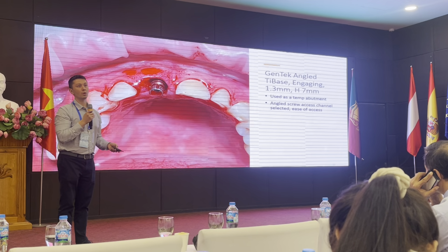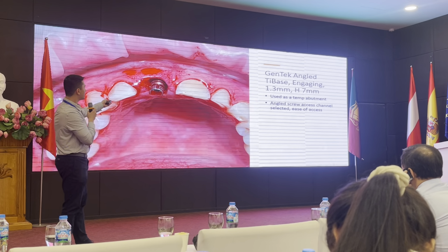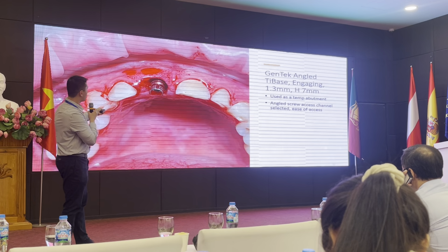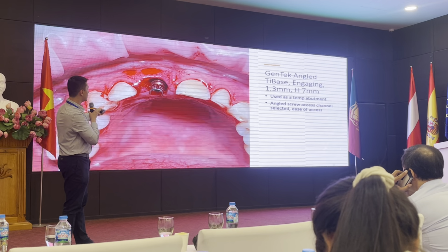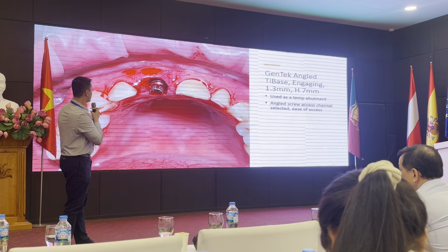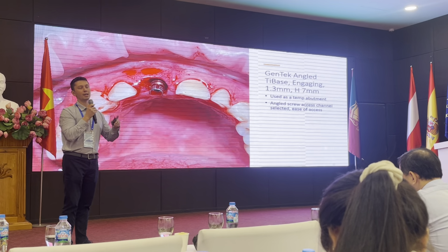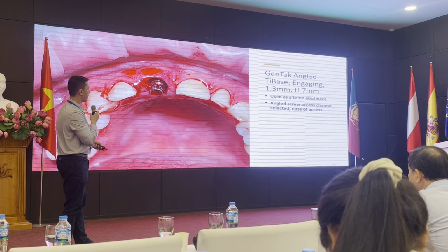Now, if we needed to, we should be comfortable doing that. We should know if we needed to. Maybe let's say this tooth had an infection and there was a bony defect on the apex of the tooth. And so maybe there is fistula or abscess formation here. We should be comfortable reflecting a flap to gain good visible access to that defect so we can clean and remove that infected soft tissue and then repair that bone. But thankfully we were able to avoid that flap procedure.